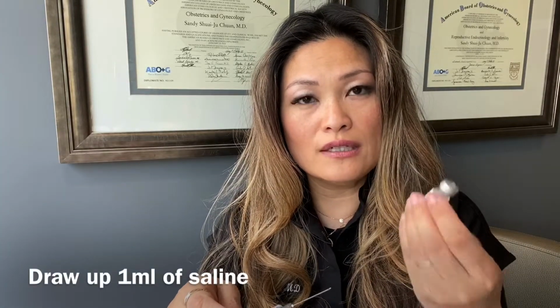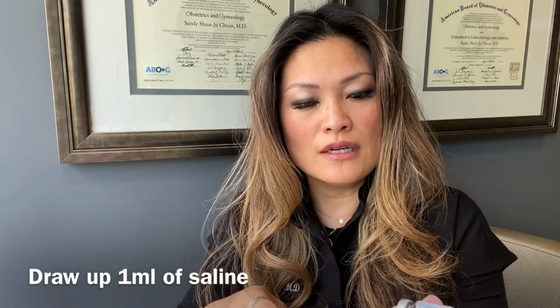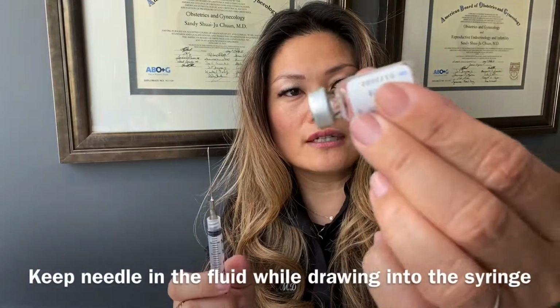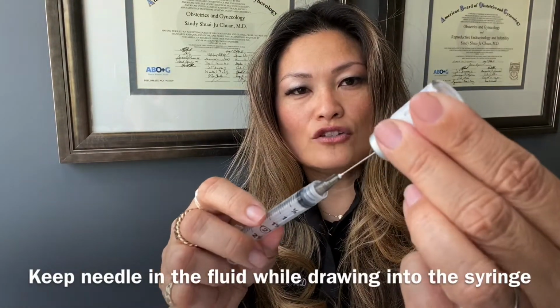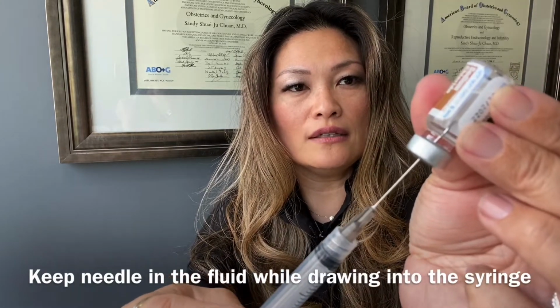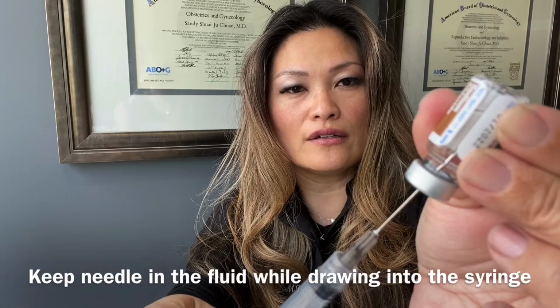So I would take this needle, and you only need about 1 ml of the fluid. It comes with 2 ml, so you really only need half of the bottle, because we don't want you to have to inject too much volume, just enough to dissolve the powder. You'll take this needle, and you can see the angle, I can show you. You want to put your needle in carefully and give it a nice push. And then you'll see how I'm keeping my needle right in the fluid? You don't want to put it all the way to the top where you're getting a lot of air, okay?